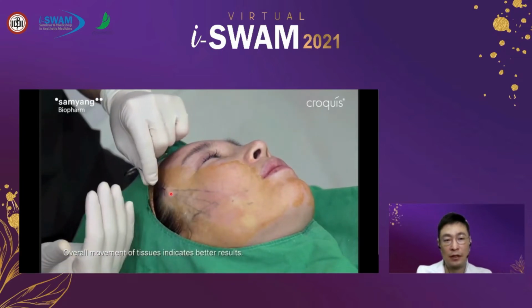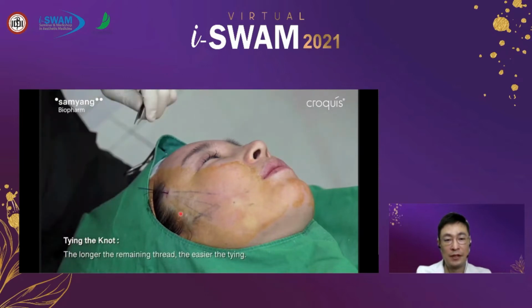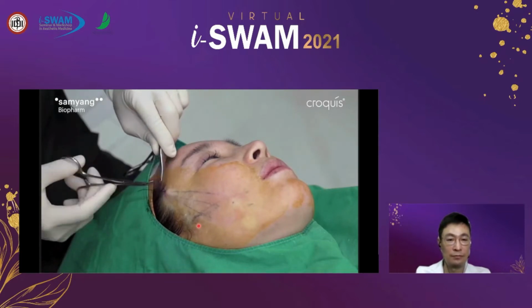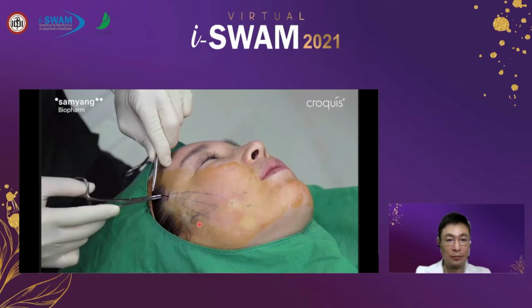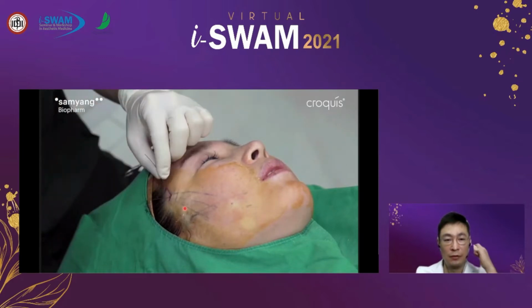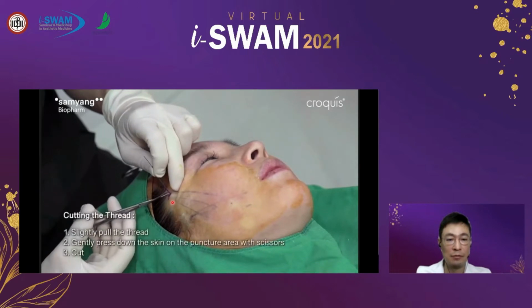And once you have put in all the threads, if you lift the thread, you will see the skin lifted very uniformly. Then I'm tying two knots. You should tie very tightly, because if the knots are released afterwards, the patients can touch the end of the thread at the entry point. And cut the remaining threads as close to the skin as possible.